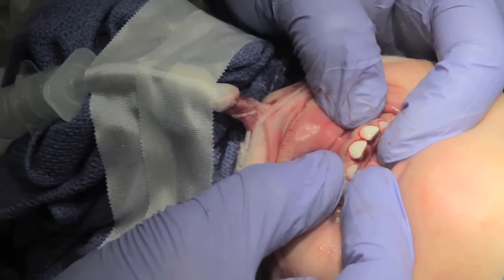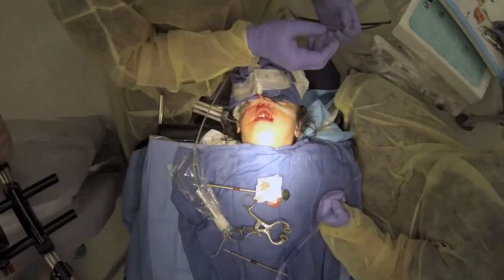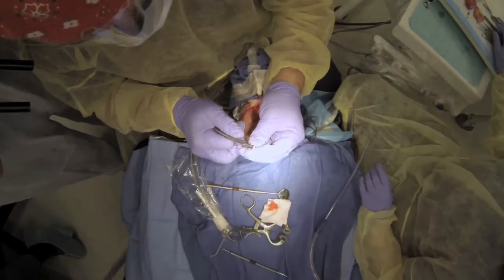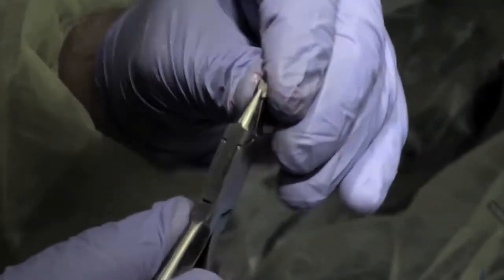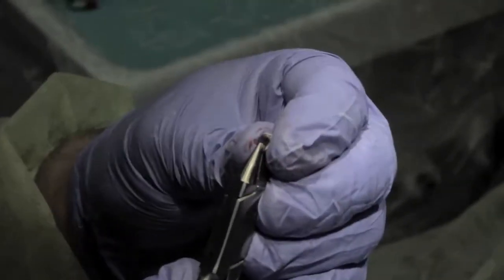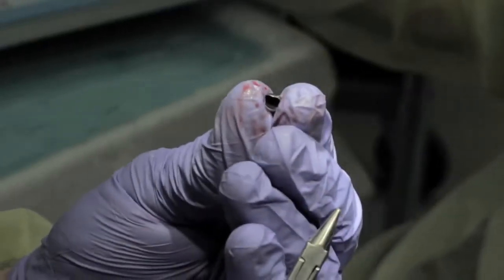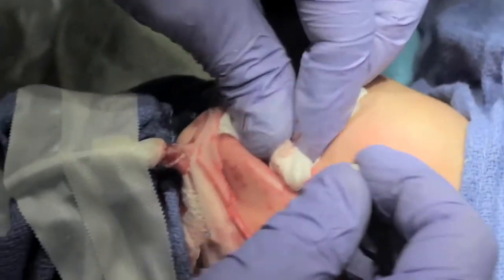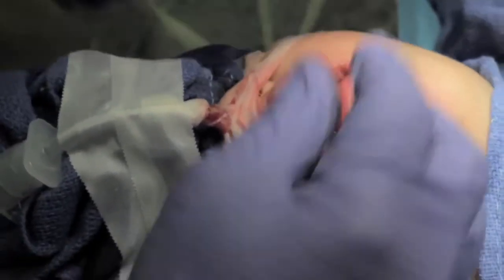The number E is a little bit loose, so I'm going to put a little crimp in that. We use a bird beak crimper — put it almost up to the bottom of the number and just give it a little push. You want a little notch, almost like a heart shape. That gives you a little notch that will hold on to the palatal of the tooth, and it snaps right on. That's perfect.